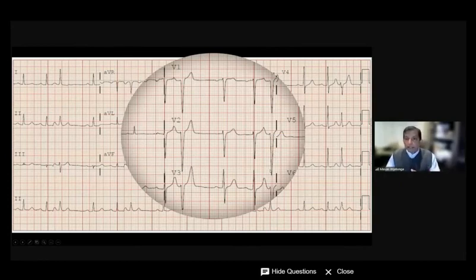So commonly, in normally healthy people, you will often see on telemetry, or if you monitor the patient, a lot of extra beats. But commonly, this conducts with the right bundle branch block pattern due to the right bundle refractoriness. But in some patients, it can be left bundle like this. So I hope that you got the key point there.